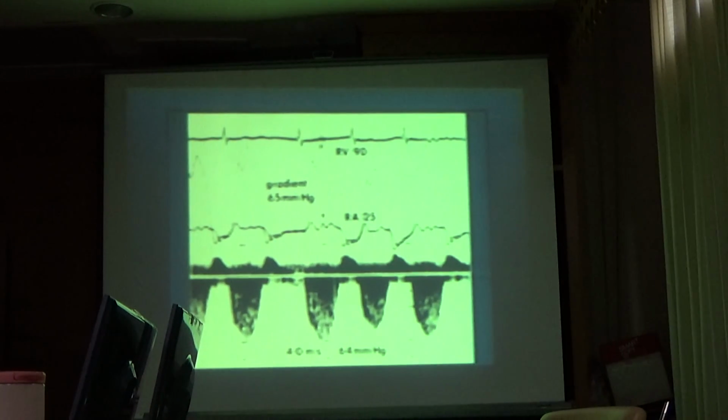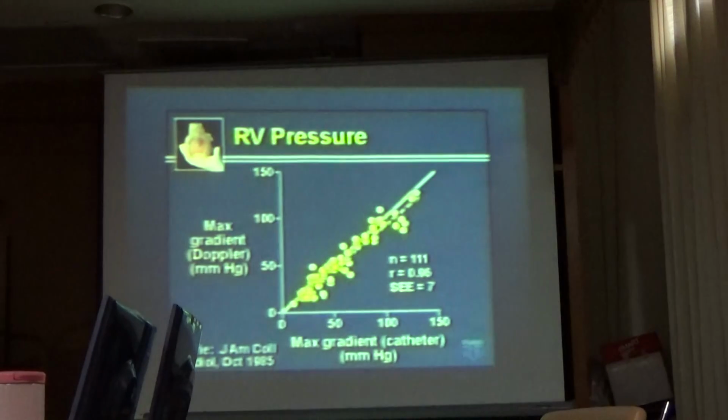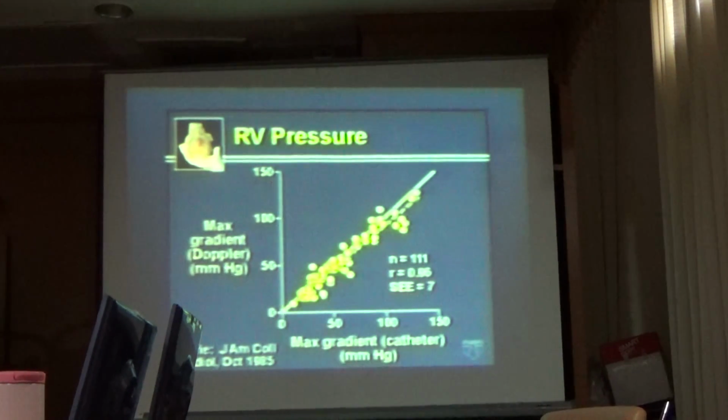As shown on this slide is a correlation study published from our own institution by Dr. Curry when he was here in the mid-1980s, showing again excellent correlation between Doppler-derived and catheter-derived right ventricular systolic pressures.